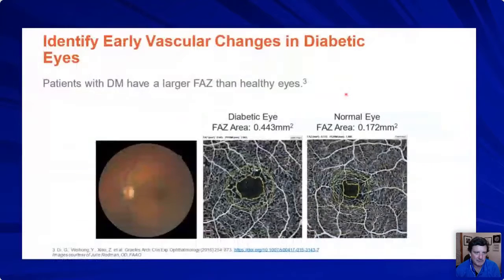This has really been fun in diabetes. And really where it's fun is that most of the time, diabetes and using this technology will affect the foveal avascular zone. And how many times would you have looked at this retina, right? I do a lot of diabetic programs in Pennsylvania. I'm working with UPMC, Highmark, Geisinger, and about 5 payers out there, getting patients back in and not having to use a fundus camera, because it's well beyond diabetic retinopathy and what a camera can pick up. So we want to get them in for the polyneuropathies, mononeuropathies, the early onset of cataract, and getting this type of technology.